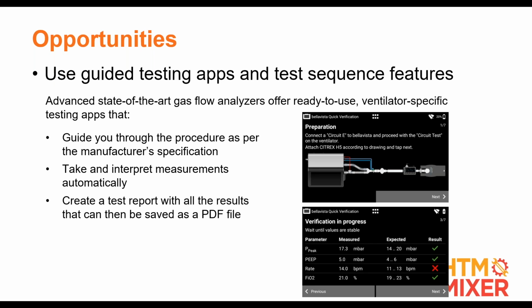Do you do updates on that? When new devices come on the market, you release new ones? We try to. In our particular case, the apps that we're building in our library, we try to develop them with the manufacturers if we can. If we can't, then we'll do them on our own.